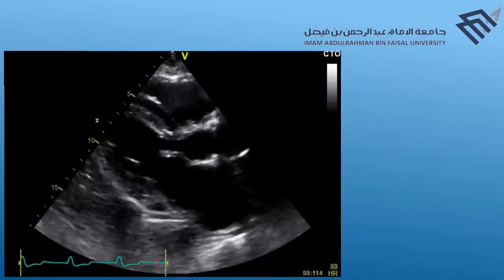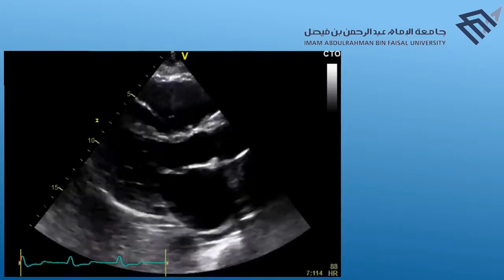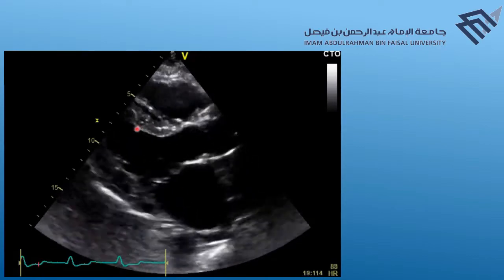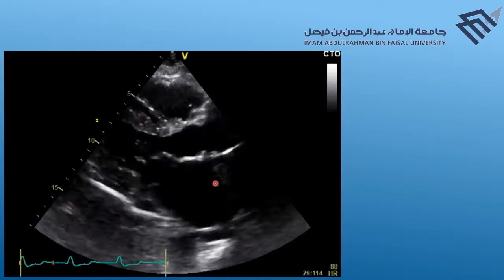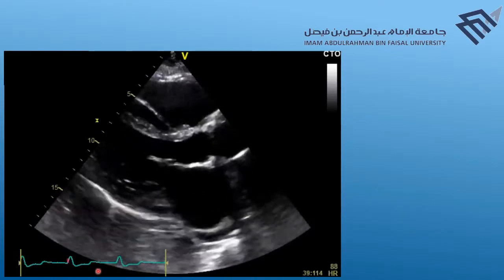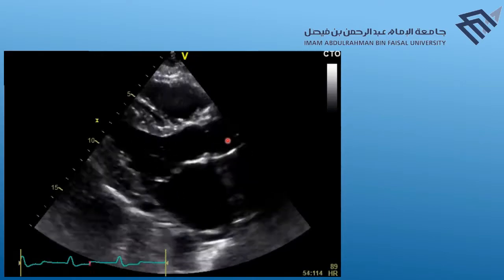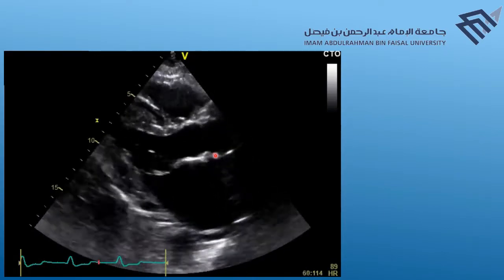So this is his left parasternal long axis view. We note here that his RV is a little bit dilated. His LV has a normal systolic function. LA is dilated. We can expect that because, as you can see here, his rhythm is atrial fibrillation. This is the place for his aortic valve replacement. The valve is bioprosthetic, and here we don't see anything suggestive of a significant problem.